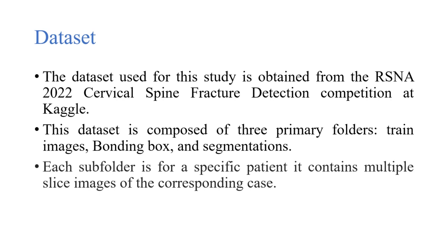Within this dataset, three main folders hold invaluable information: train images, bounding box, and segmentation files. Each folder is dedicated to a specific patient, containing multiple slice images pertinent to the corresponding case. This comprehensive dataset serves as the foundation for training and evaluating our model, providing a diverse range of medical images for a thorough investigation into cervical spine bone detection.